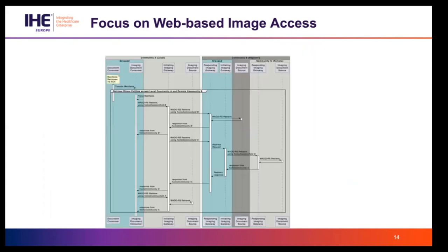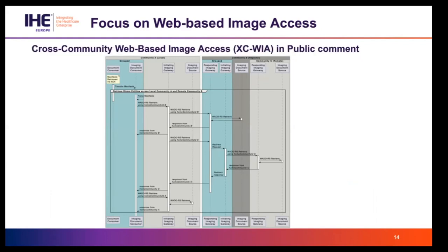and things like that. The new profile, the XC-WIA we mentioned, which is currently in public comment, is extending that same WADO-RS transaction to be used across the boundaries of different communities.